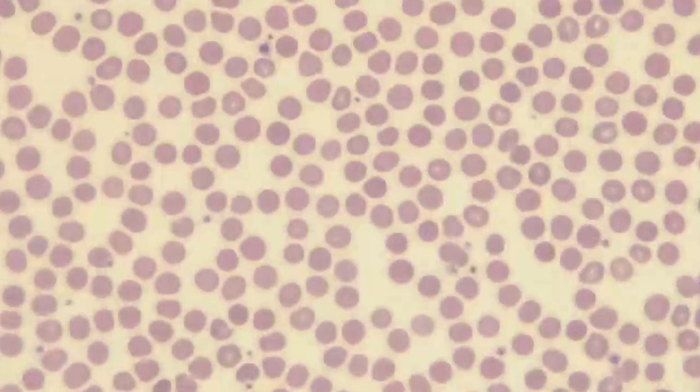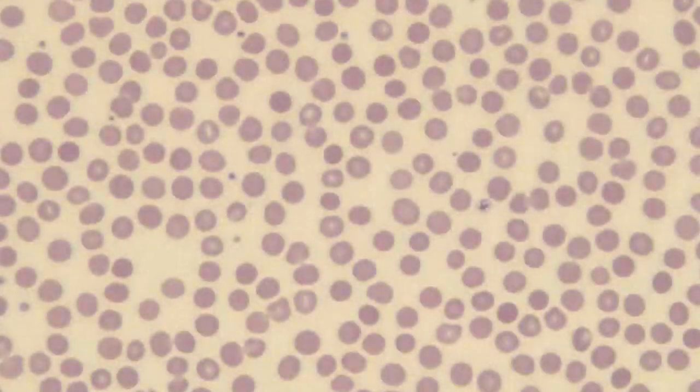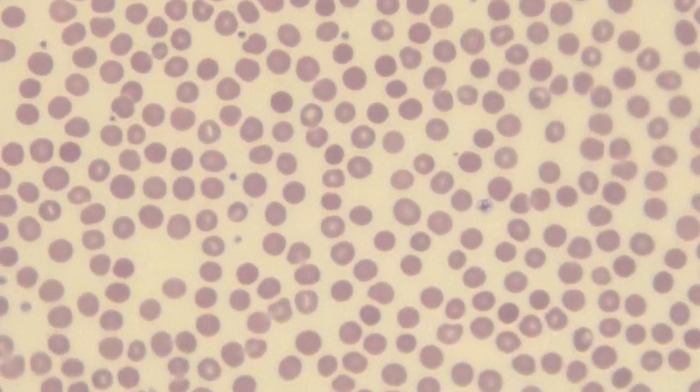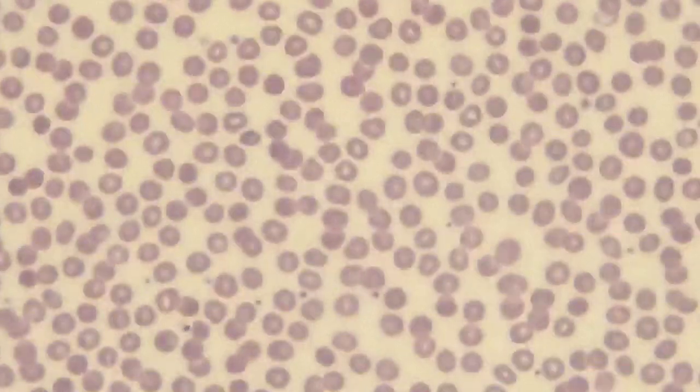Now I have to determine where I would start my differential. We are going to go up to 40x for that. This is 40x dry, so we refer to this as the high dry lens. What we're looking for at this point is where the red cells are just starting to touch each other, or maybe not quite touching each other. If we look here, we can see that the red cells are just starting to overlap a little bit. There's a good spacing between them.